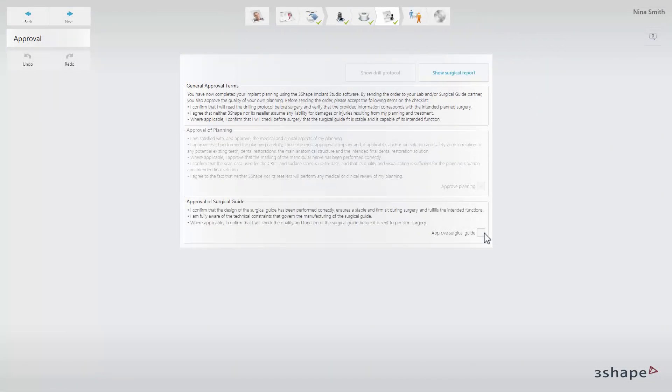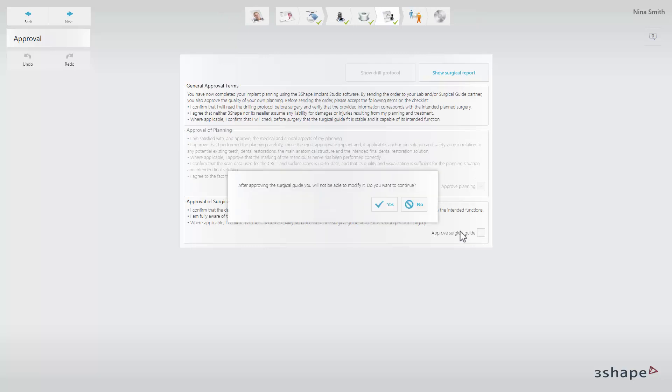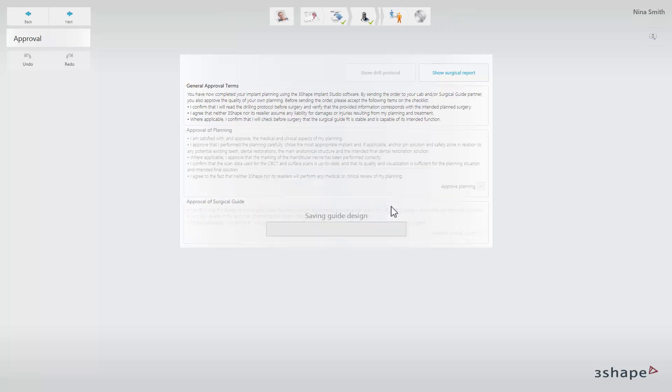Keep in mind that when you have approved the implant planning and guide design, you cannot modify the order.